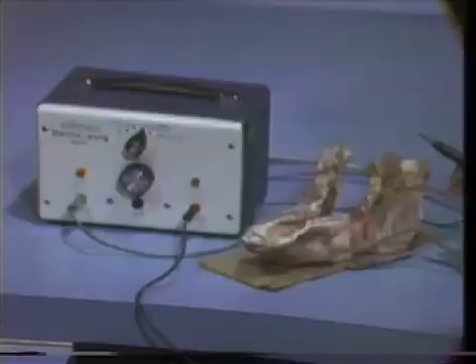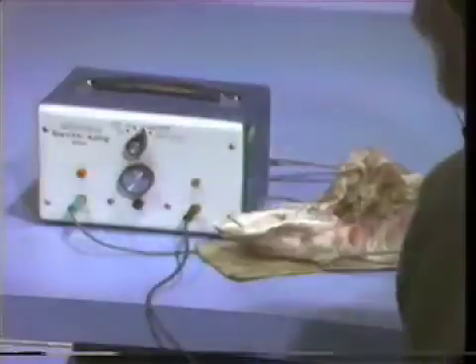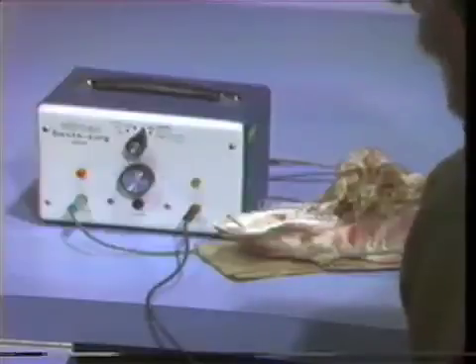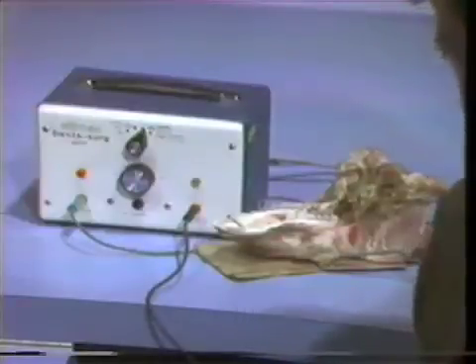For this part of the demonstration, we have the Elman unit on in the coag position. The power output is adjusted to almost full output, and the active terminal is plugged into the fulgurite unit. What we plan on doing is to illustrate the ill effects of improper settings of the electrosurgery unit. The switch is in the coag position, the output is turned almost all the way up at about eight and a half, and the active electrode is plugged into the fulgurite terminal.